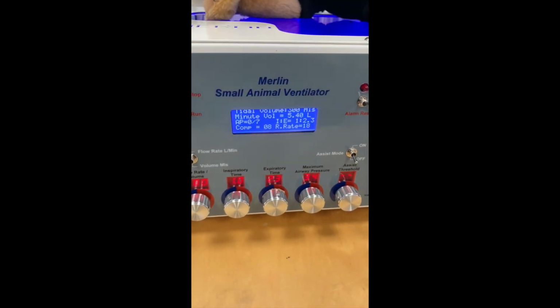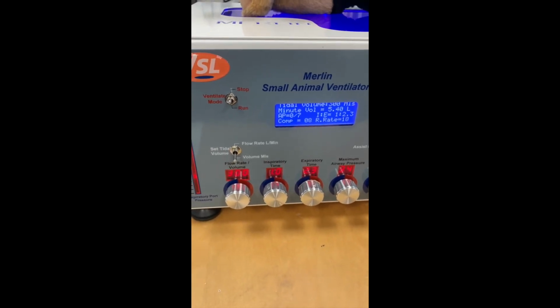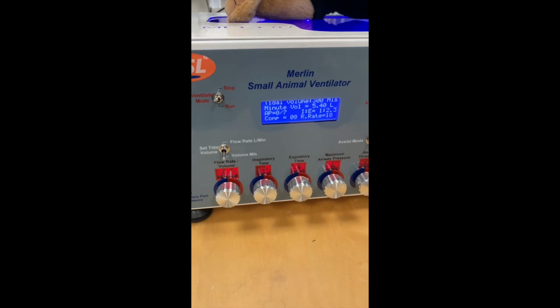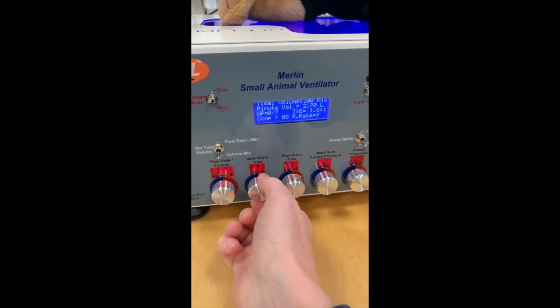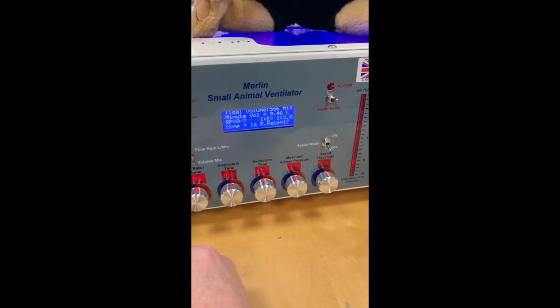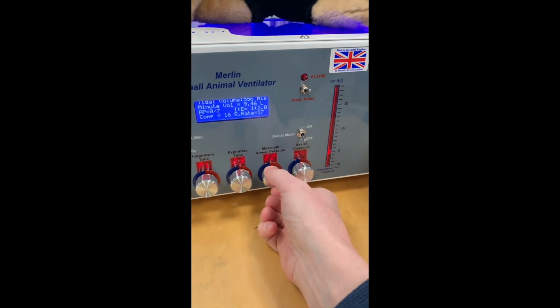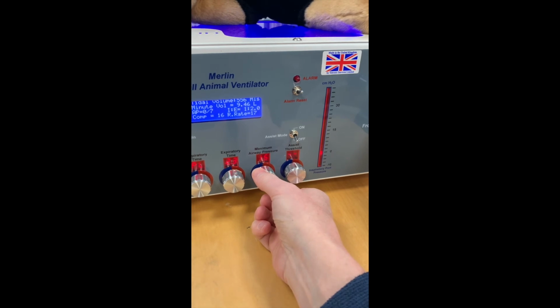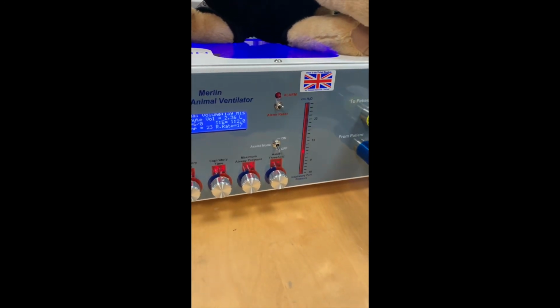It's easier to demonstrate the effect of PEEP using pressure cycling mode. Only easier for the demonstration. It makes no difference to the PEEP in use on the machine at all, but for the purpose of the demonstration I'm going to put this to pressure cycling mode. So if we go to a flow rate of 9 litres a minute and we have a target pressure of 15 centimetres. Okay, we'll set this running.